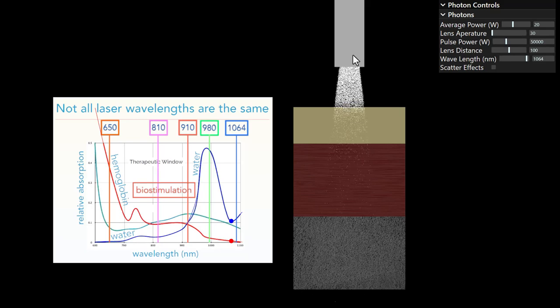What I have here is a laser emitter, the wand or handle that emits the laser energy. This might be attached to a machine or a robot arm. Laser light, or any energy in the form of light, is made up of photons. I represent photons here with these white particles. You see this going into tissues—skin, muscle, bone—and there's an apparent depth that this goes into. They start to fade out right around here. These different parameters will change whether we get more superficial or more deep, spreading the energy out over a wider distance.